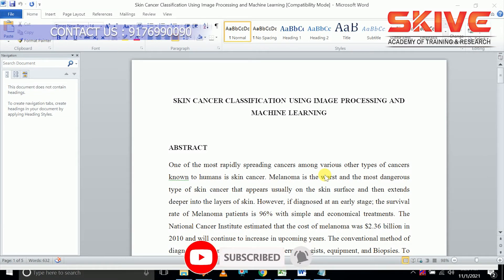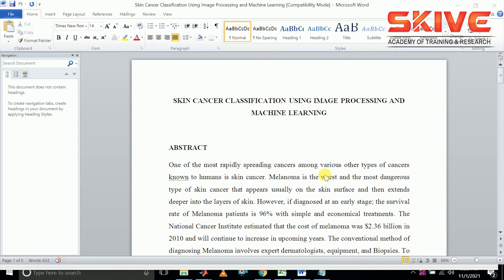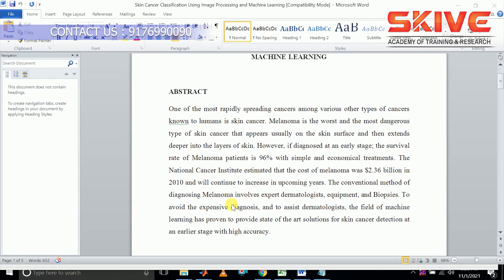This project is skin cancer classification using image processing and machine learning. Skin cancer is one of the most spreading cancers among various types, and melanoma is the most dangerous skin cancer — it not only affects the surface region but also goes in depth to damage the cells. Early detection and treatment will save patients, and here we are going to propose a system for early diagnosis of skin cancer.